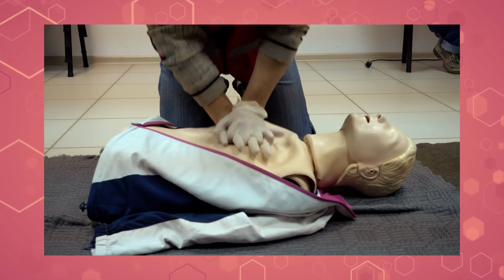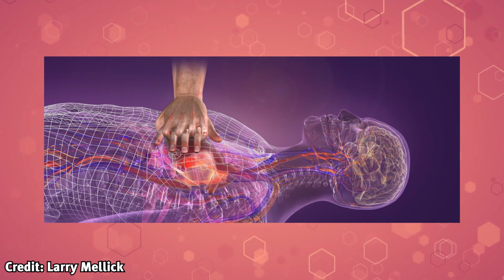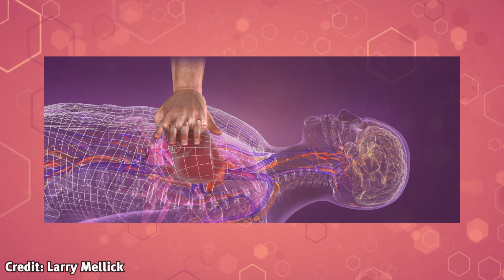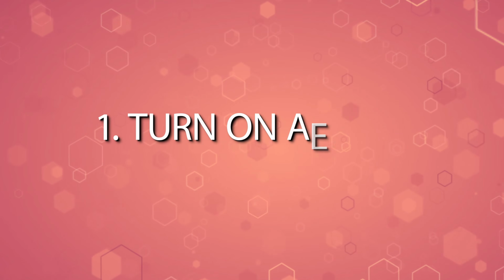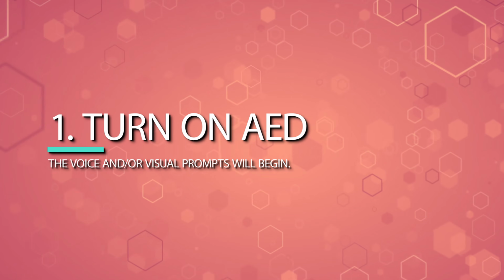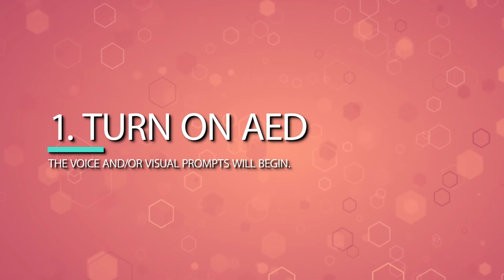If possible, have someone trained in CPR begin chest compressions. This will keep the heart muscles activated while you prepare the AED. Step number 1. Turn on the AED. The voice and/or visual prompts will begin.